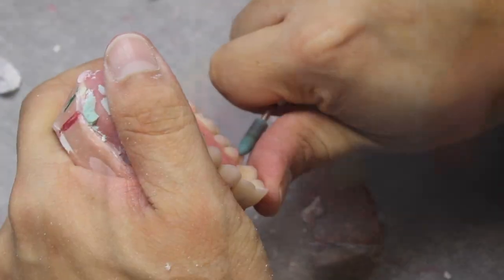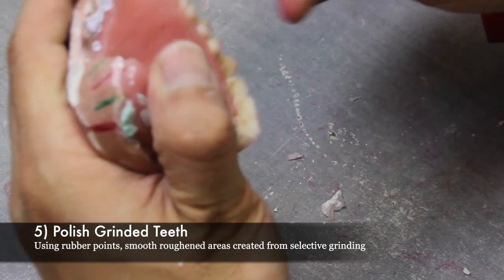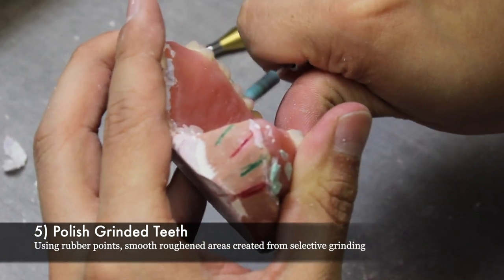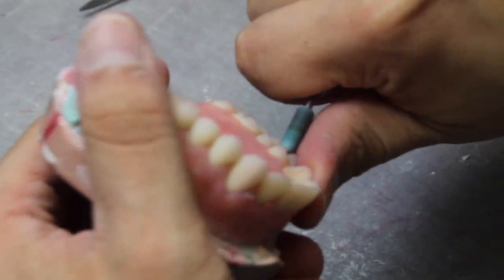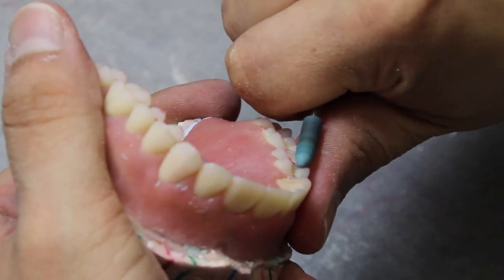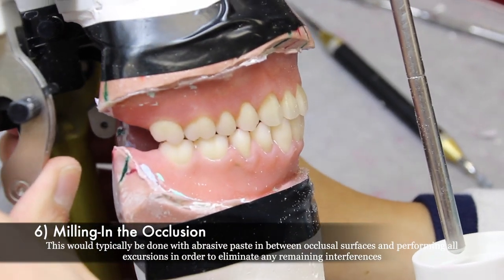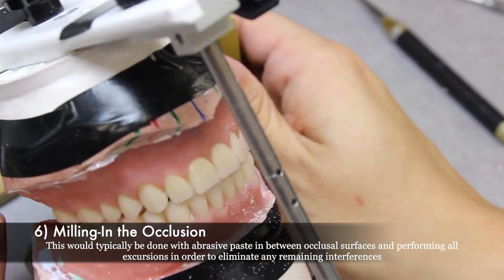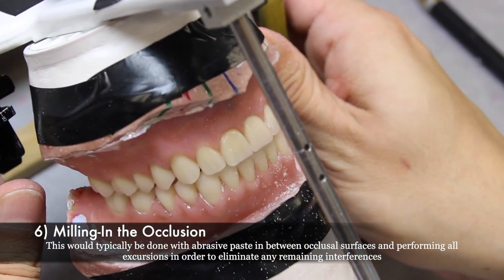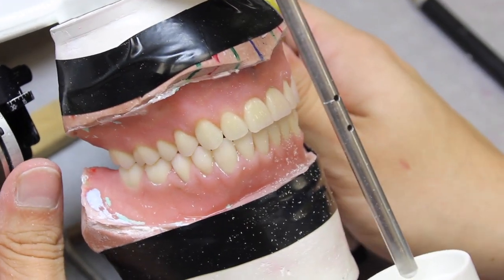Once the protrusive interferences have been removed, you may now polish the selectively ground teeth. Using rubber points, you can smooth the roughened areas created from selective grinding. The next step is not commonly performed; however, you can mill in the occlusion. This would typically be done with an abrasive paste in between the occlusal surfaces and performing the excursions in order to eliminate any remaining interferences.